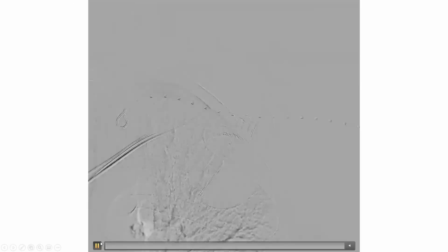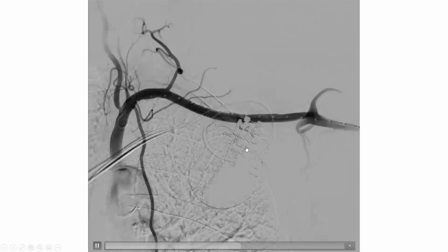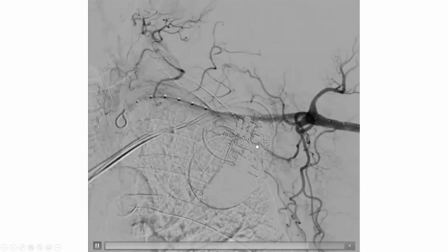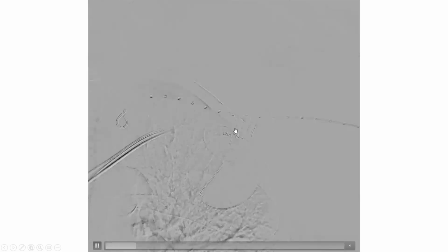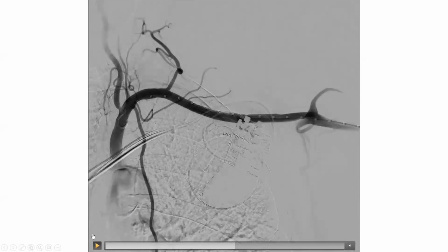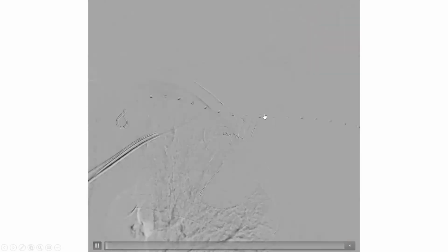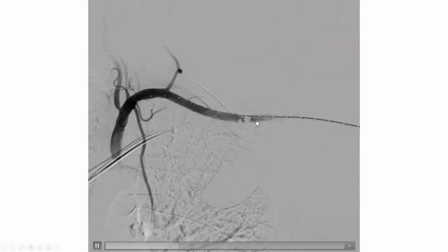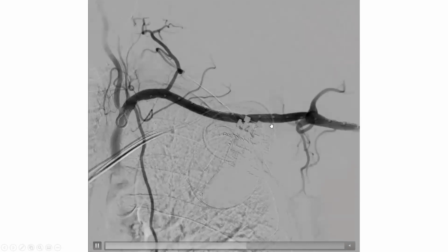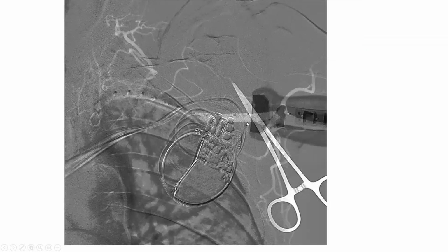This is an illustration of an angiogram in a patient with an ICD, and you can see the subscapular artery. Even with the ICD, you can still see the lateral thoracic artery coming. You see that? It will come and hug the chest cavity, so you want to stick close to it. With an ICD, I end up having to stick somewhere here, a little more laterally than I wish. So I position my probe somewhere here.